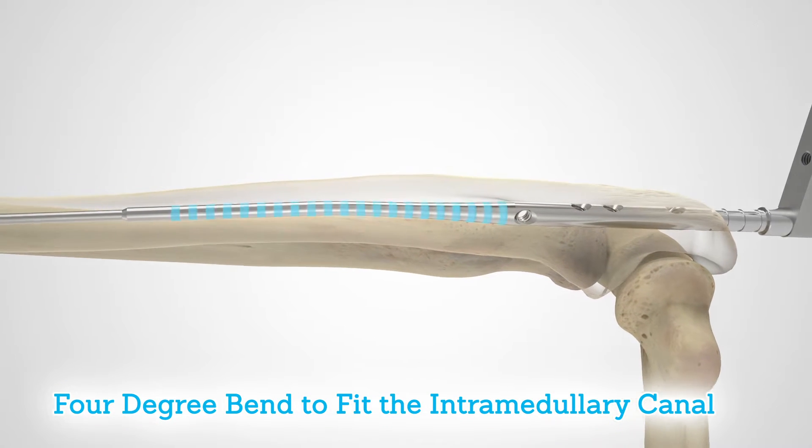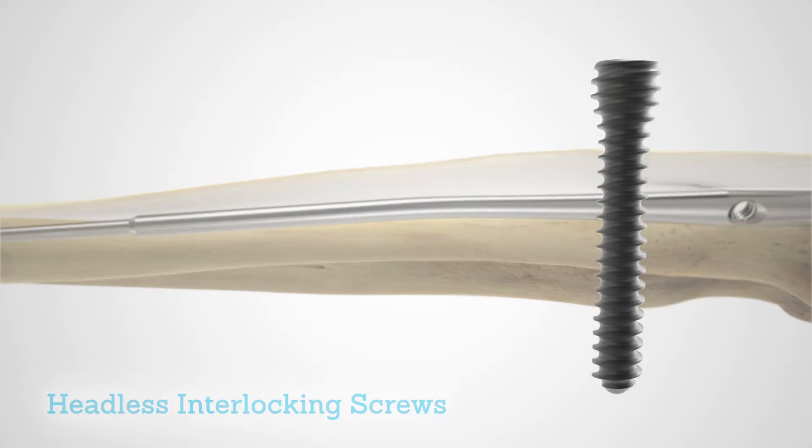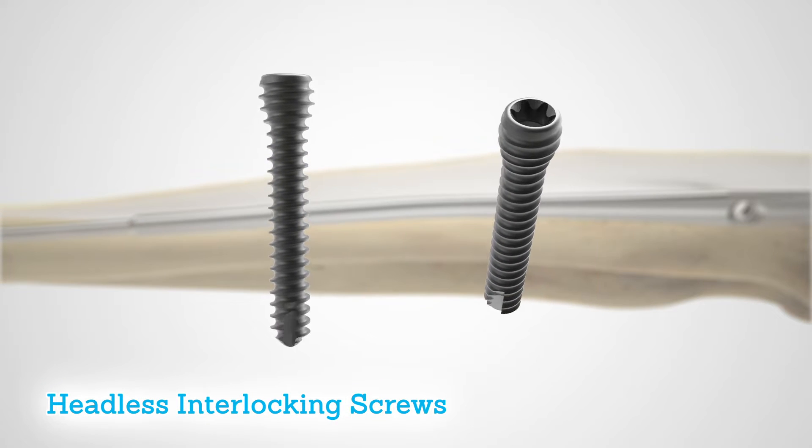Designed with a 4 degree bend intended to fit the intramedullary canal, the nail accepts headless interlocking screws to minimize soft tissue irritation.